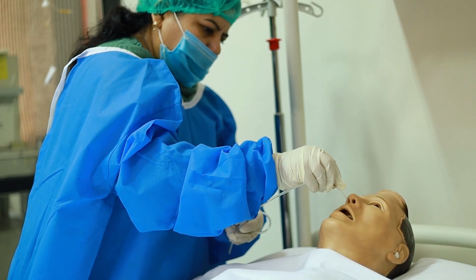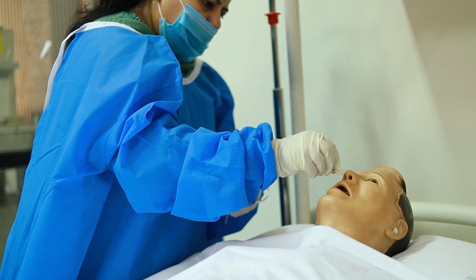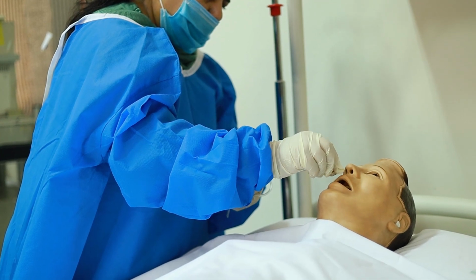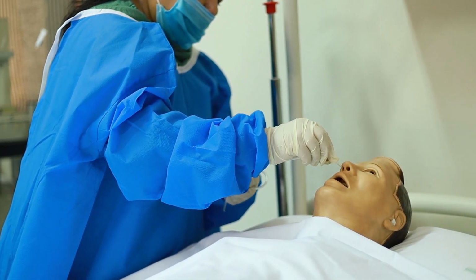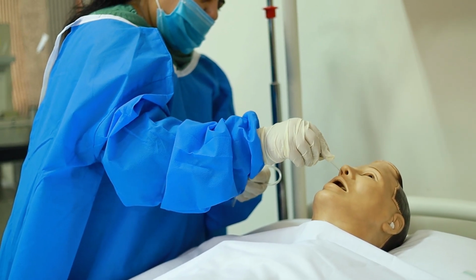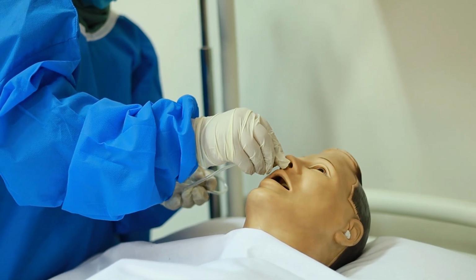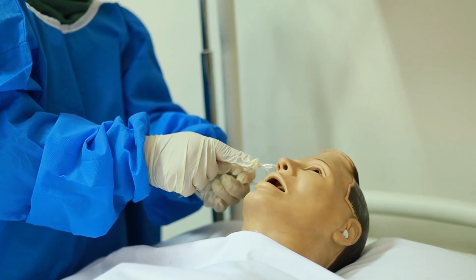If you see any resistance, rotate the tube slowly downward. Do not force the tube. You can also withdraw the tube if you see any changes in the patient's respiratory status. Pass the tube until the mark is reached.